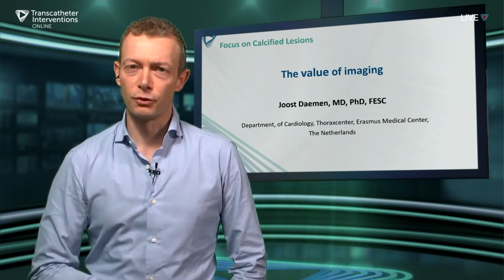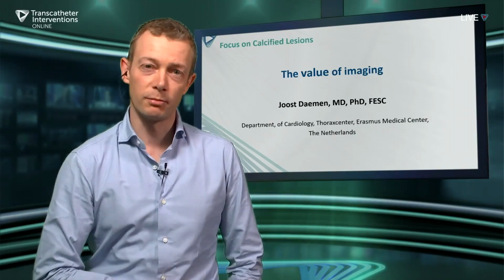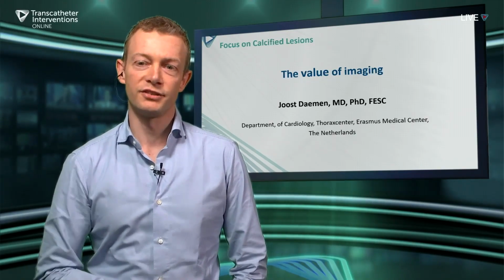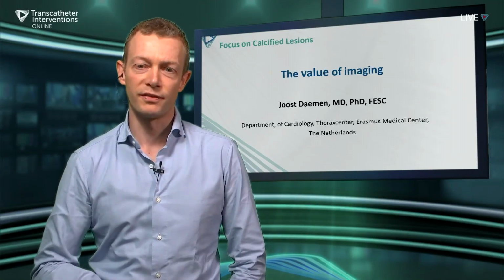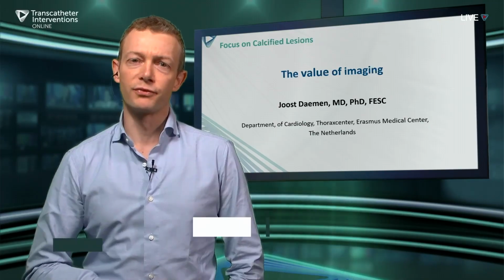As you know, calcium has been an old foe. That was already recognized in 1979 when Andreas Grüntzig published in the New England Journal of Medicine that, at that time, the balloon dilatation technique was limited by anatomic factors such as calcified lesions. Calcium is a problem and it's very frequent.